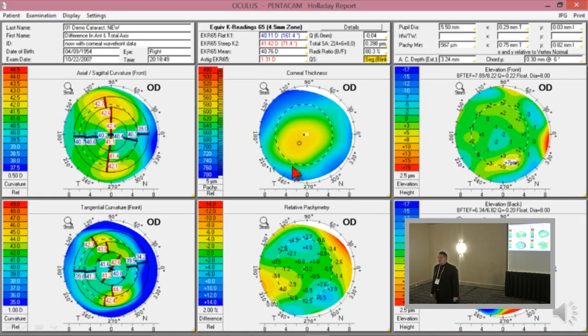So make sure that you go through your technicians, and you just do it on me one time, just like you would for a patient, and then you find out. But make sure that they have the patient blinking frequently and then stop, and bam, half a second later, so you can focus while they're blinking. And then when you get it in the right position, stare and then bam. It should be within 1 second of the time that they stare. It should never be more than 1 second after the last blink. That's the point.